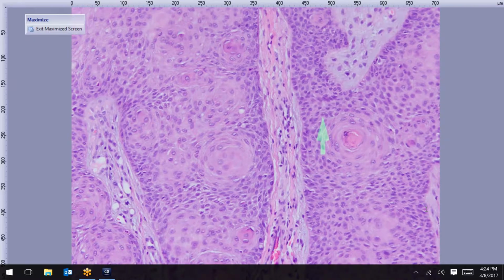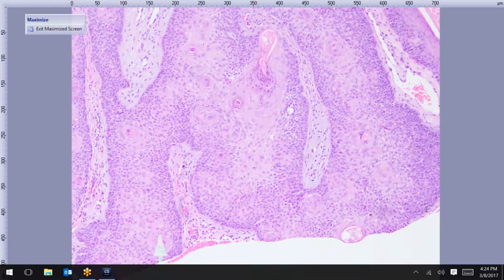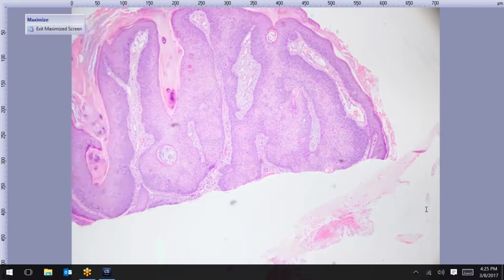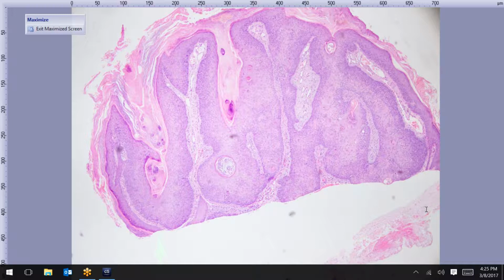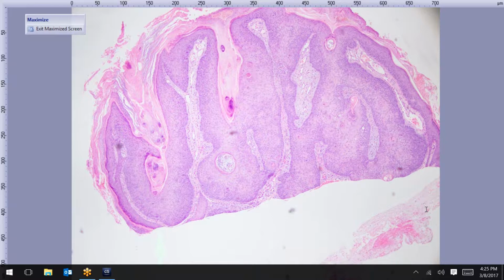These are perfect textbook squamous eddies, all throughout here. And somebody put in inverted follicular keratosis. That's exactly what this is. It has a lot in common with the entity known as an irritated seborrheic keratosis, or inflamed seborrheic keratosis. The difference is that it's endophytic, with more follicular differentiation, and you do get squamous eddies. So this is a real good example of an inverted follicular keratosis.